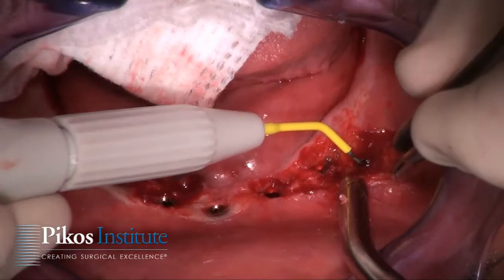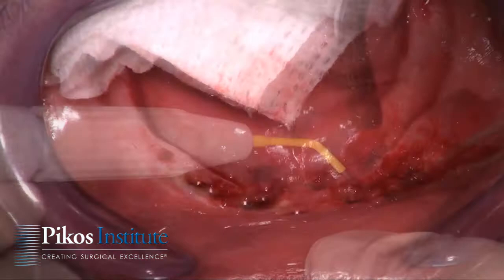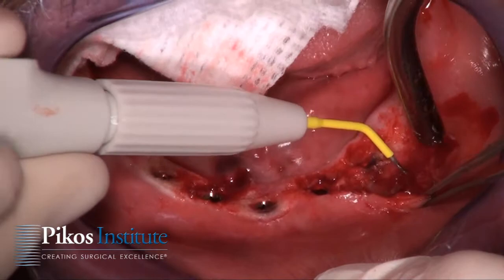You can see just a nice brushstroke motion — we have to clean this needle tip periodically. Just in a sweeping motion, and just as if I had a blade, I'm going to be parallel.